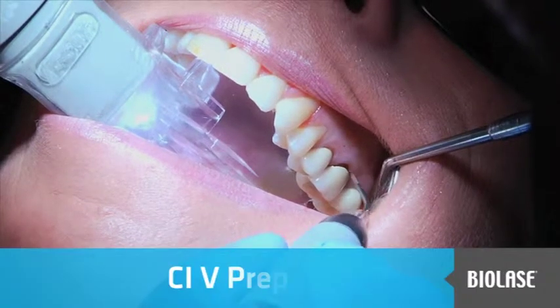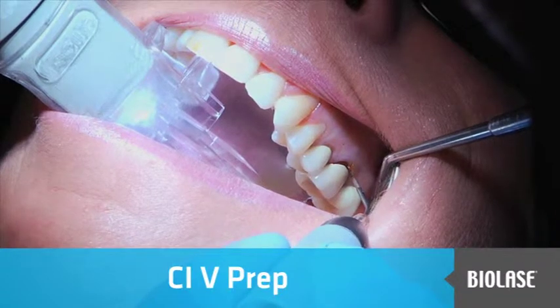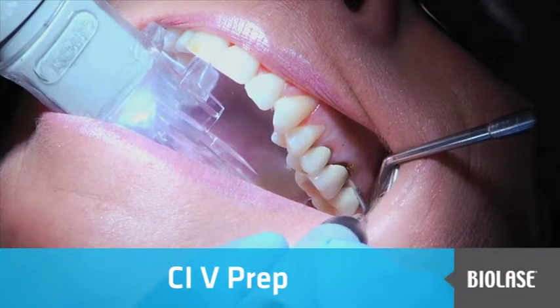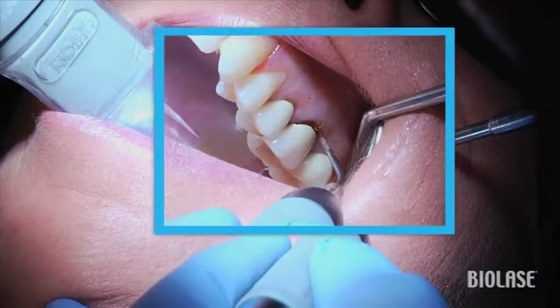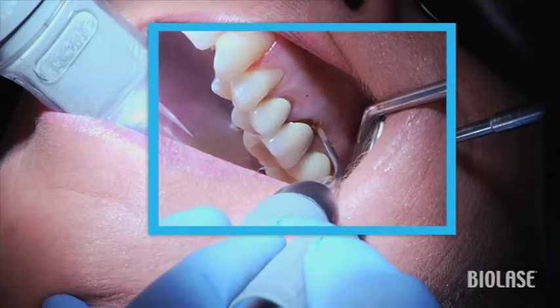The diode laser can be a great tool to treat Class 5 caries that extend below the gum line in a minimally invasive manner. In the past, this procedure would require flapping the tissue and would present a problem controlling bleeding while trying to place a restoration.